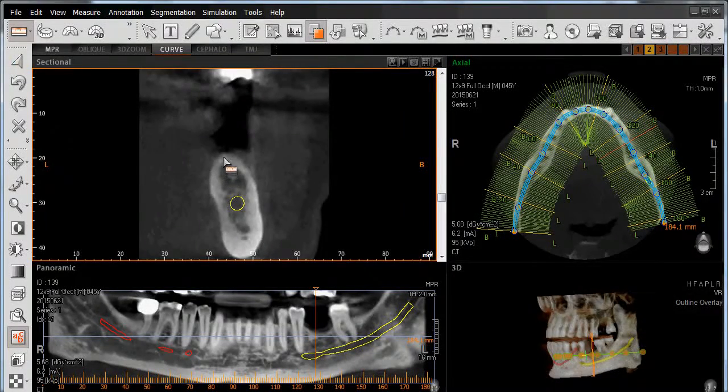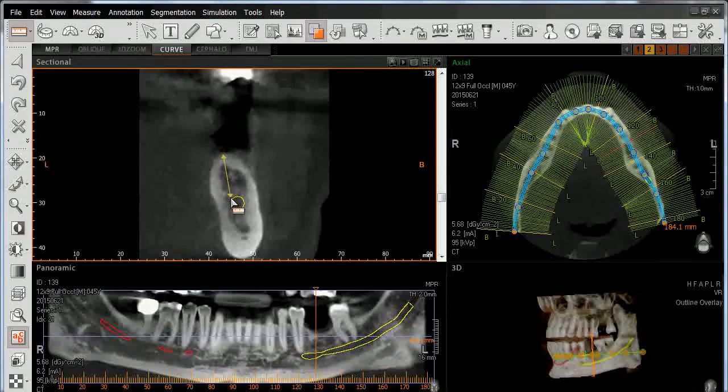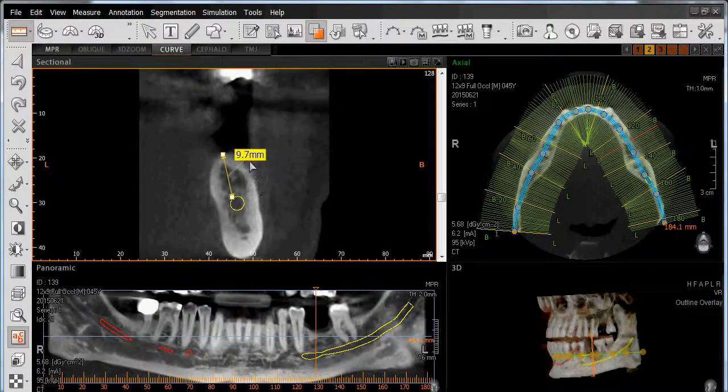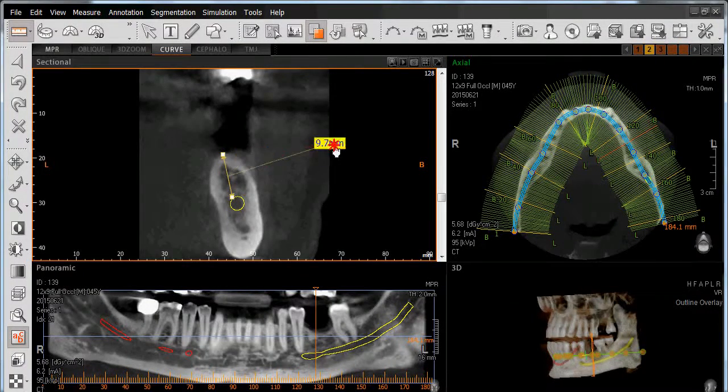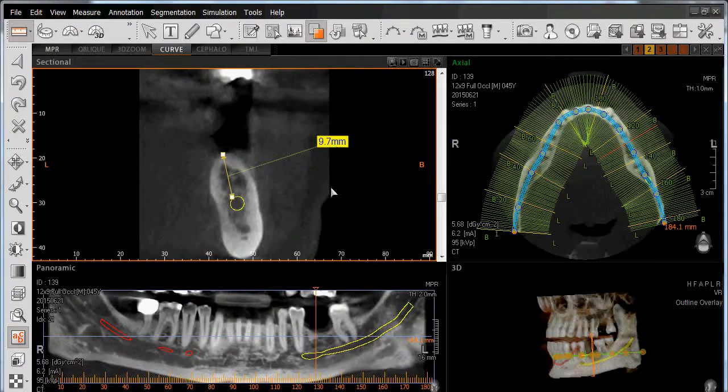In this case, we'll measure from the ridge down to the superior border of our nerve, which gives us a distance of 9.7 millimeters.